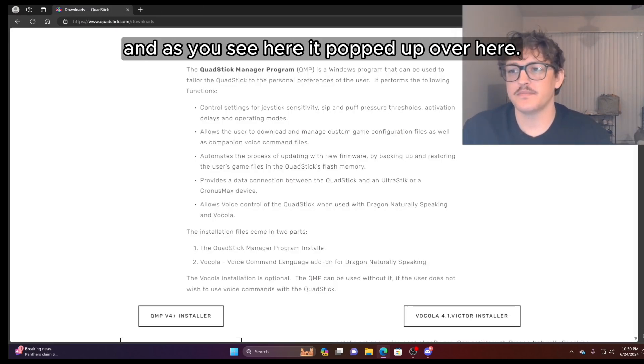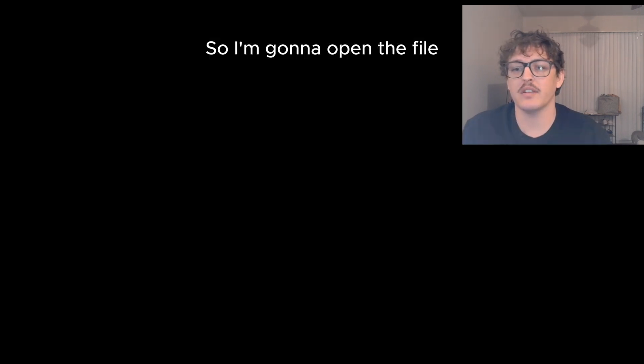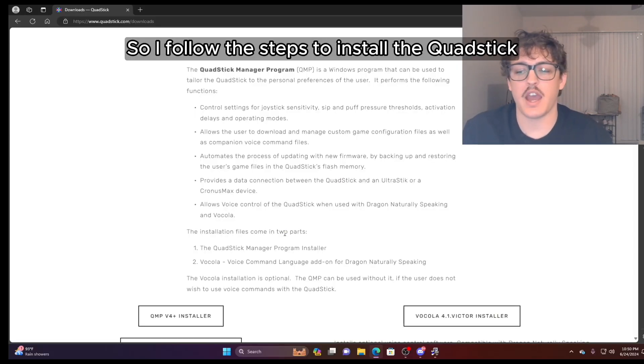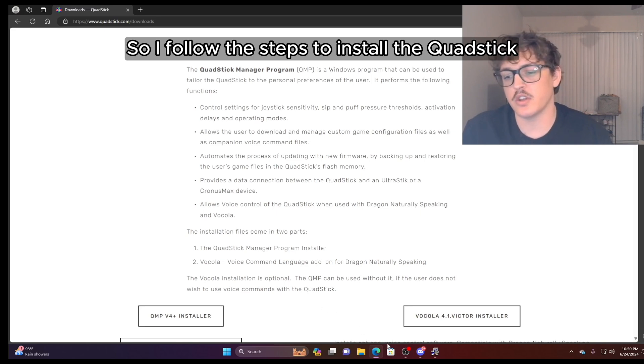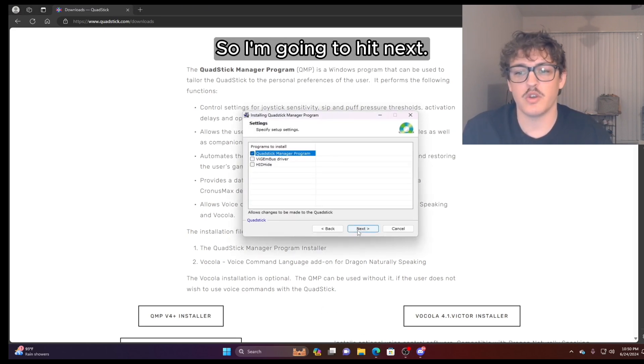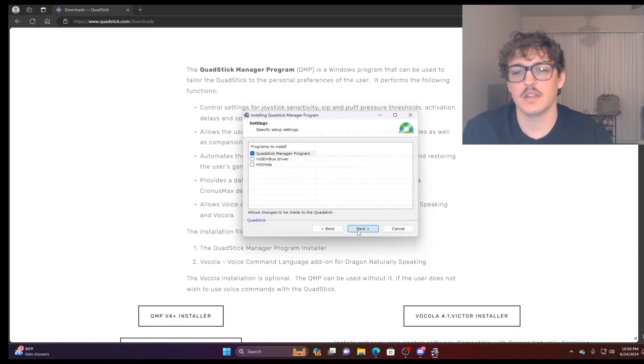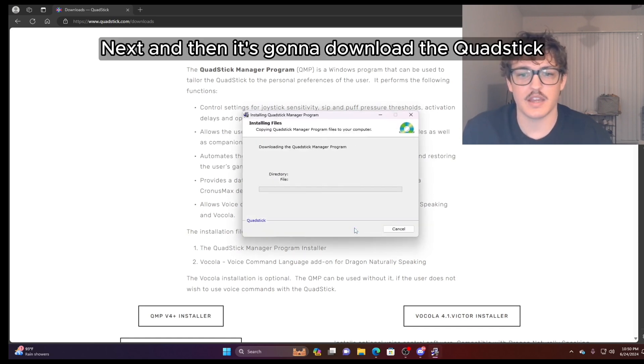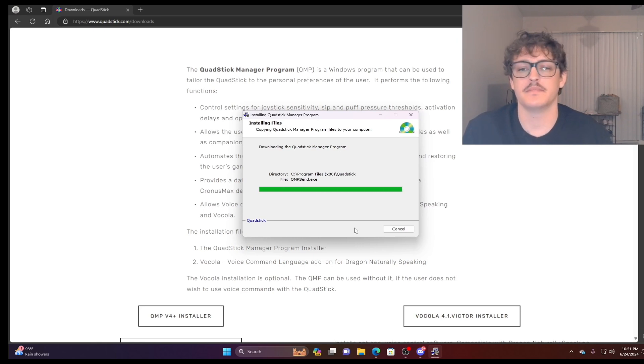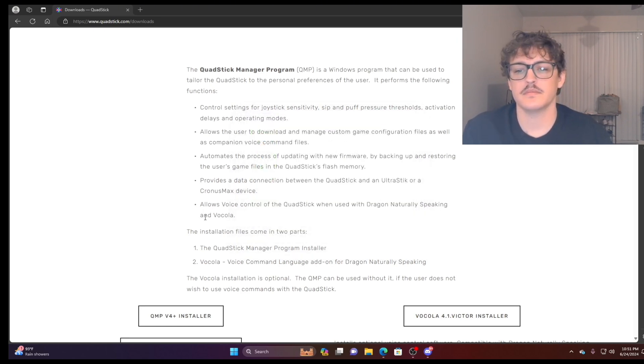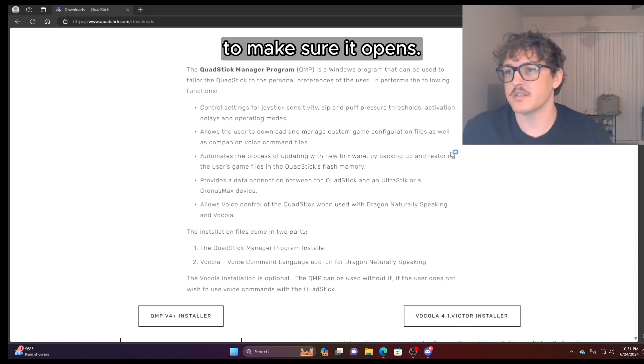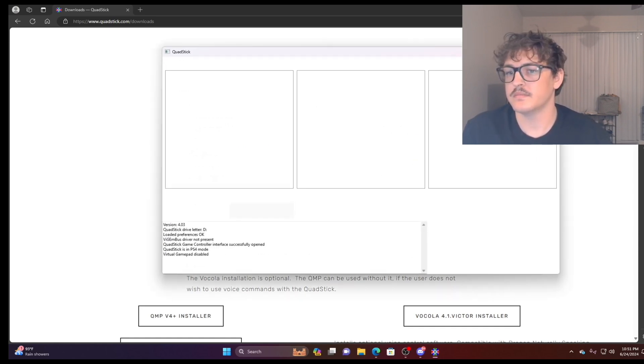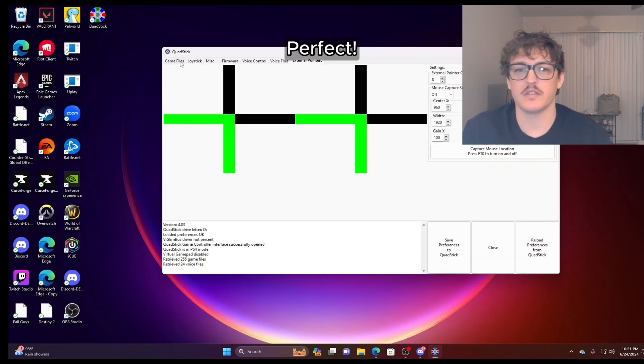And as you see here, it popped up over here. So I'm going to open the file. And then my screen probably went black and I'm going to hit yes. So I follow the steps to install the QuadStick manager program. So I'm going to hit next, next, next. And then it's going to download the QuadStick manager program. And then now we're going to run the program to make sure it opens. Perfect.